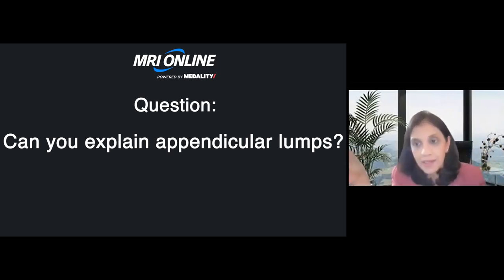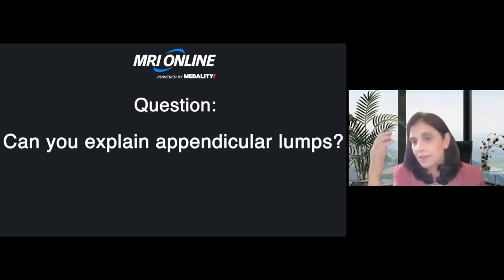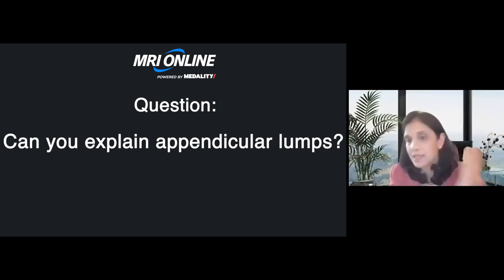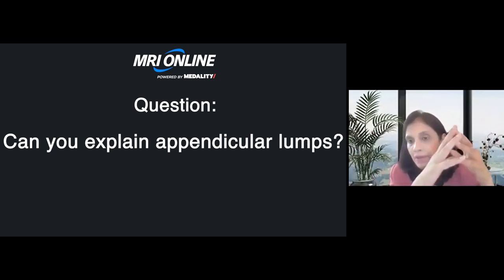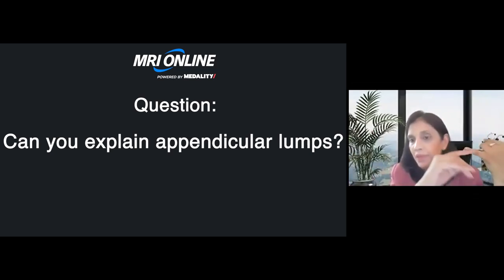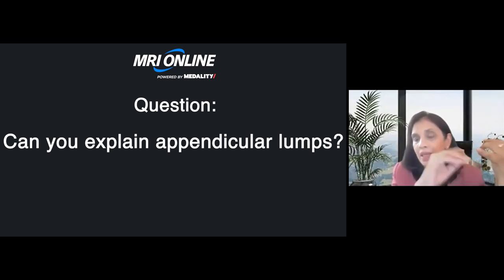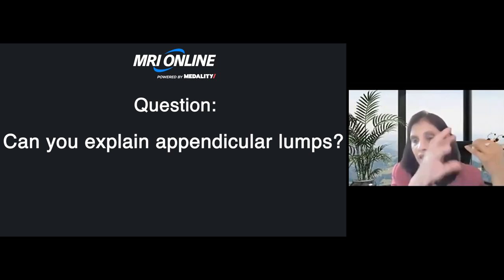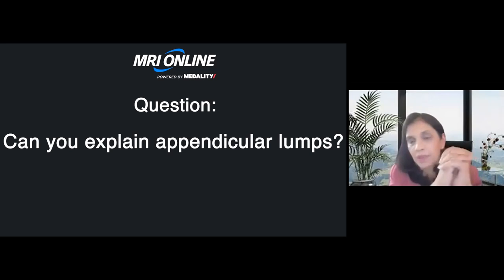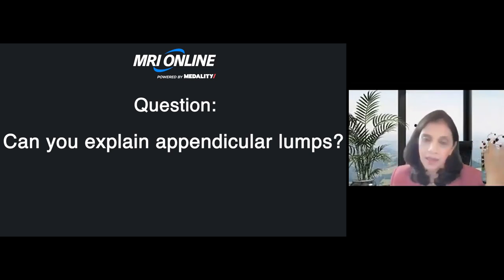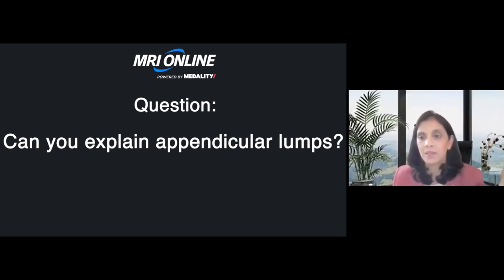Please explain appendicular lump. When you see an inflamed appendix with or without a fecalith and just hyperemia, that's appendicitis. However, if there is perforation, any leak, abscess, or collection, all of these are grouped under appendicular lump and must be managed accordingly.